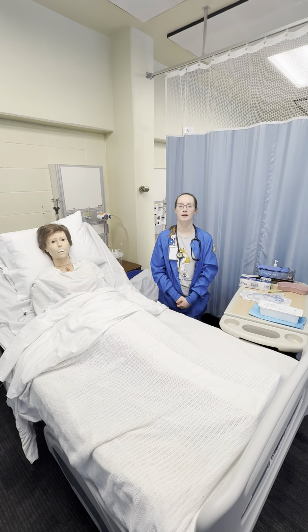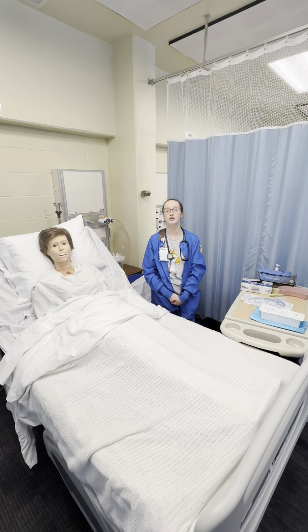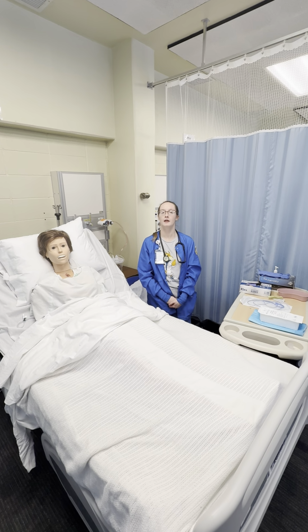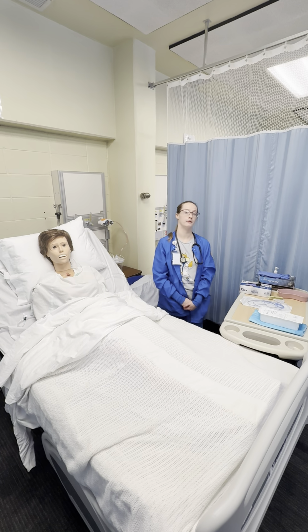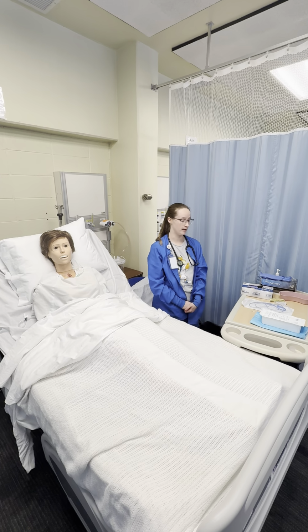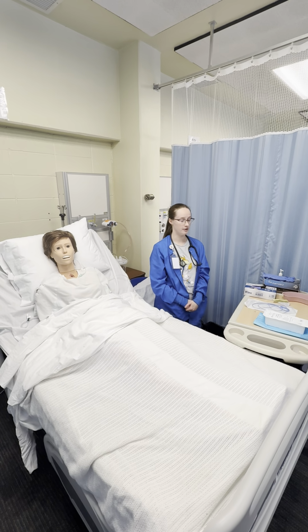My name is Jamie and I'm a nursing student, and today I'm going to be demonstrating the placement of an NG tube using my general principles and safety practices and following my 11 medication rights. I would start by verifying my order for an NG tube and making sure that I have the appropriate reason, the appropriate equipment, and the appropriate tubing. I have all of my stuff set aside and everything's been verified.